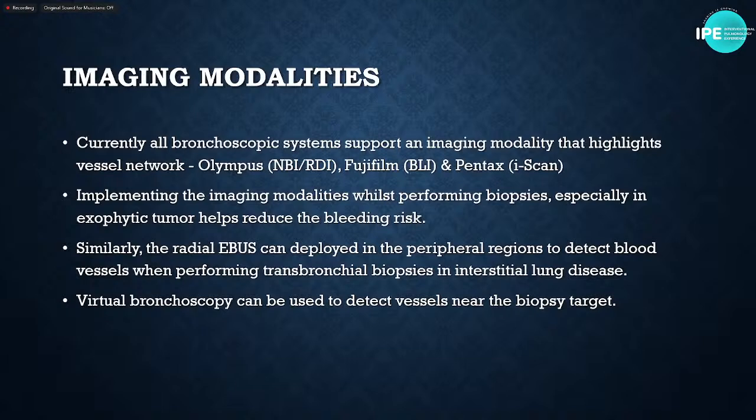And of course, if you want to go for the more expensive version, you can do the virtual bronchoscopy, because the virtual bronchoscopy not only tells you where you can go or how you can take the biopsy, but also highlights the vessels that are in the region.